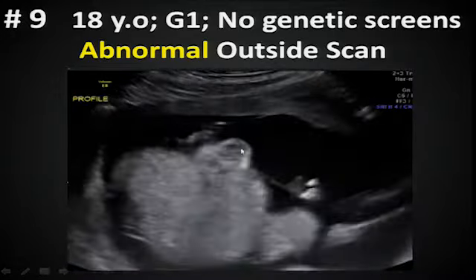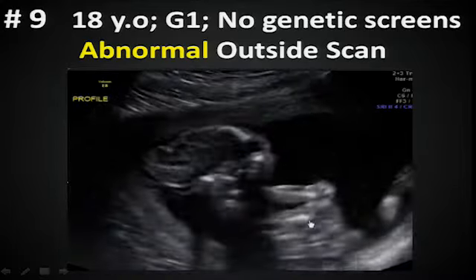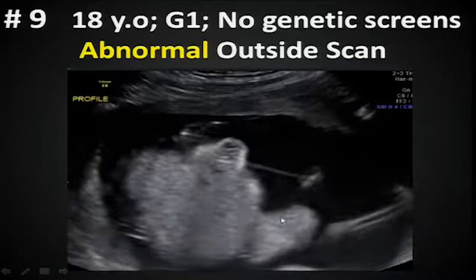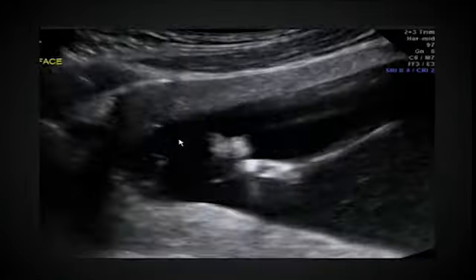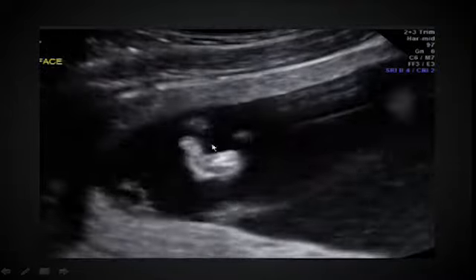So we've got normal fluid, so we know that at least one kidney is working and that there's a way for that urine to get out. It's looking across the front of the face. This is looking at the chin, the cheeks. Here's an orbit with the lens of the eye. Look here, there's this big cleft, following it all the way up through the orbit. And then we see this little attachment. And again in real time, looking at the front of the face.